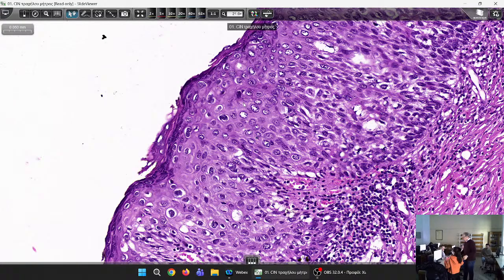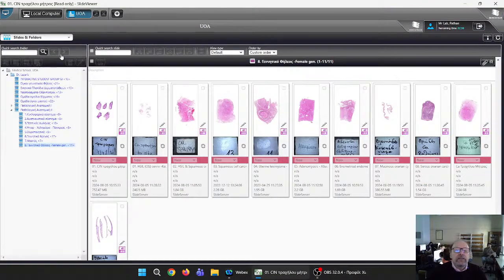Yes? So for high-grade, the HPV is inside, yes, but you no longer see the koilocytic atypia. However, it is an HPV-related lesion. But when you see the koilocytic atypia, this is consistent with low-grade. And you see an increase in the nucleus, an increase in the nuclear size, in an increased thickness of the squamous epithelium. Always more than 1/3.